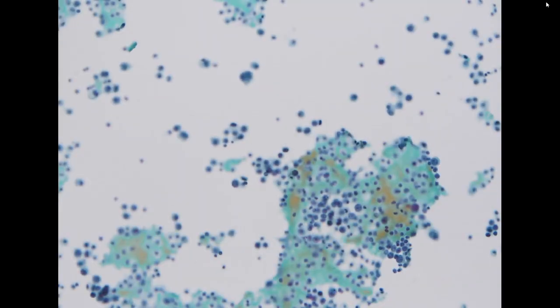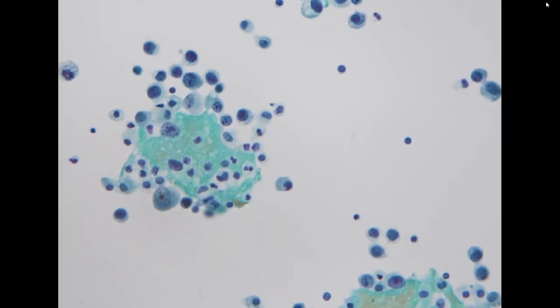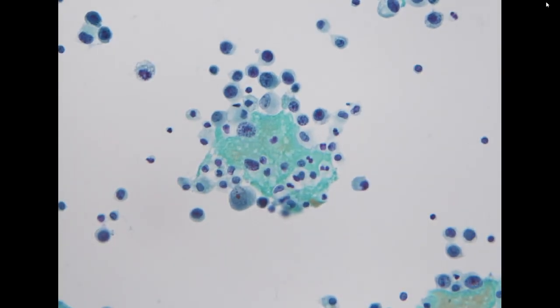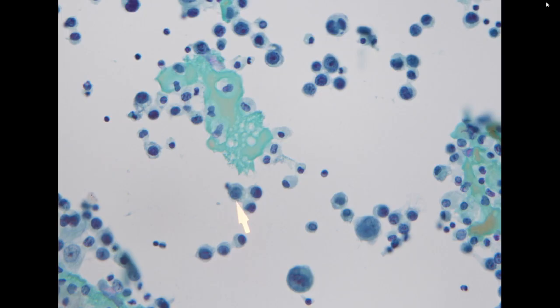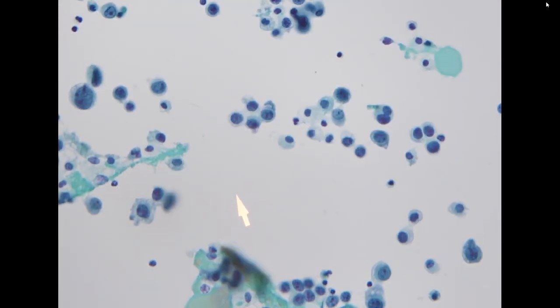Okay, back to the pleural effusion. Here we have a gastric cancer case. This is pleural effusion. Here we see high-grade cells, mostly single cells, some with eccentric nuclei. So this is typical for poorly differentiated gastric cancer.